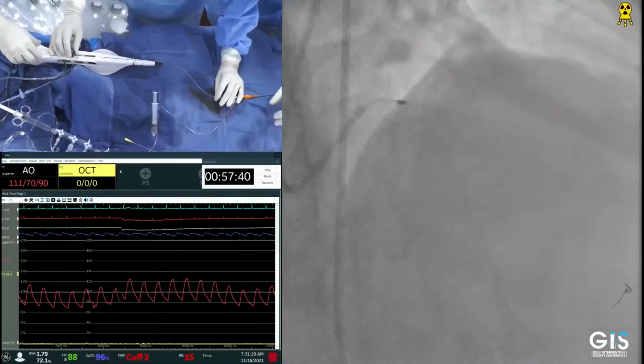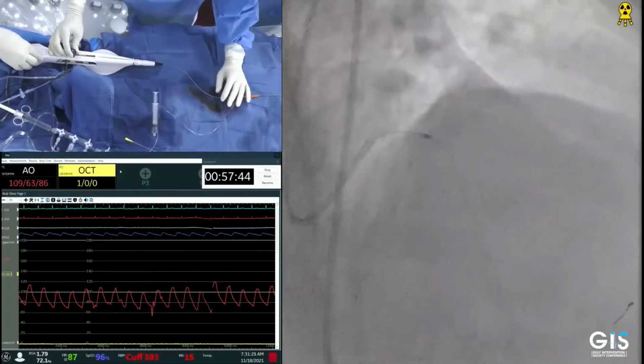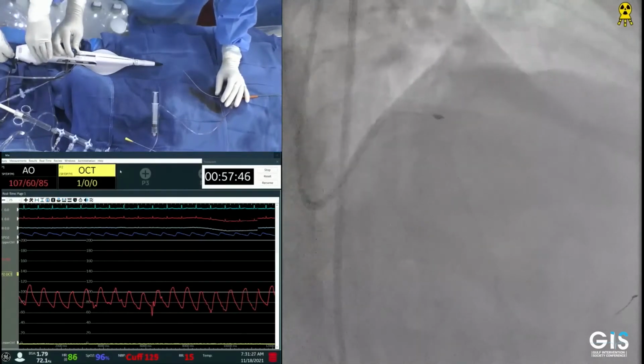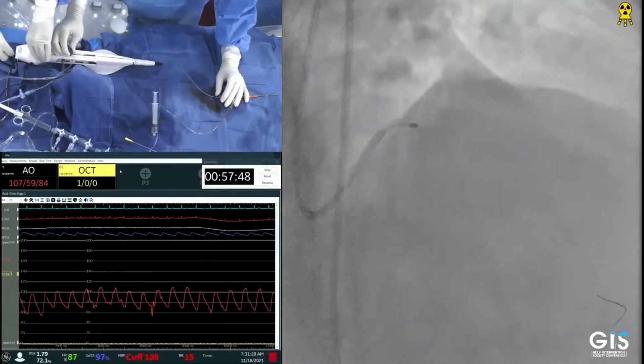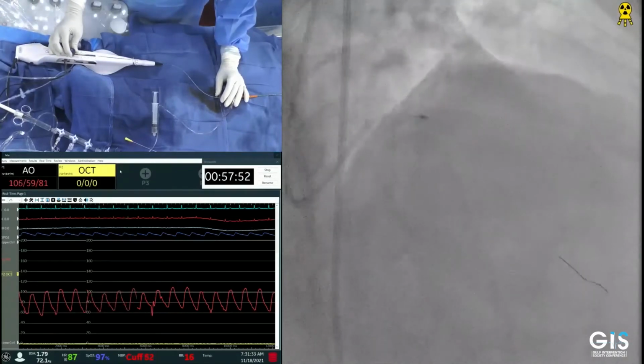It's always important to look at your wire where you burr, the distal wire. Pull the wire back a little bit. Pull a little wire. Yes, enough. Keep going. So we're going at 155,000 RPMs, per minute.